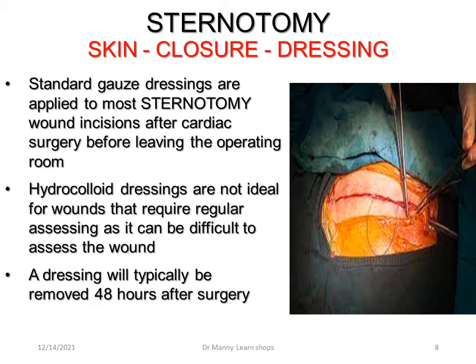Transparent dressings can be used to visualise, and that way you can see fluid accumulation as well. But typically, standard gauze dressings are the ones that are recommended. They absorb moisture. They can be visualised fairly easily when blood or whatever fluid, plasma, seepage, can be coming through the dressing.